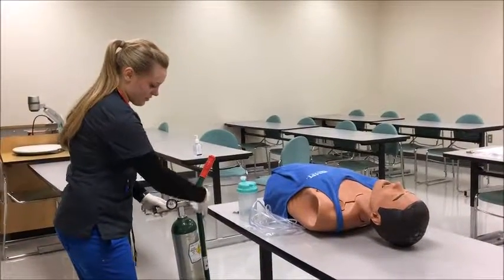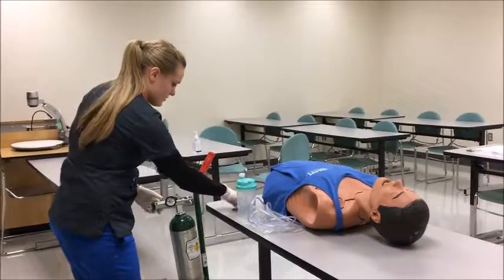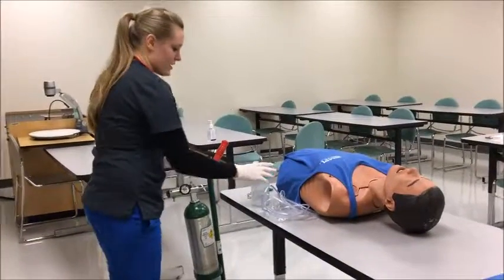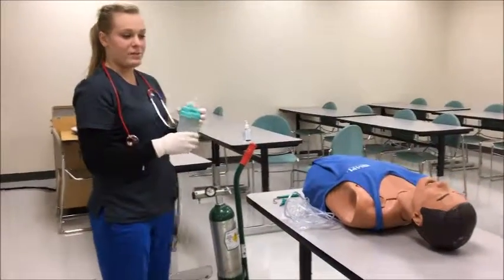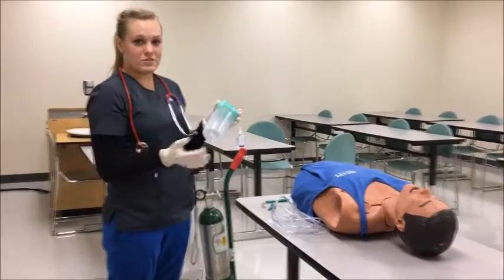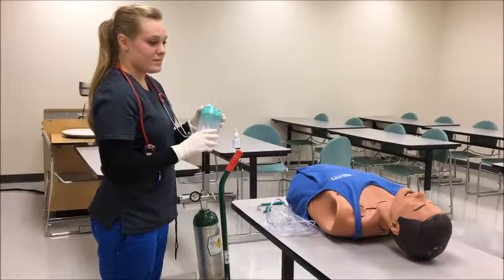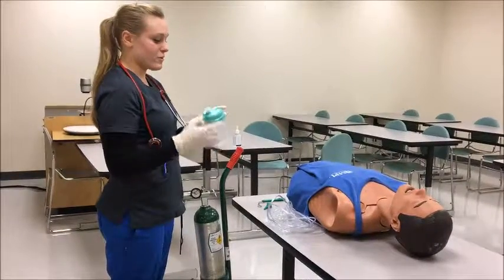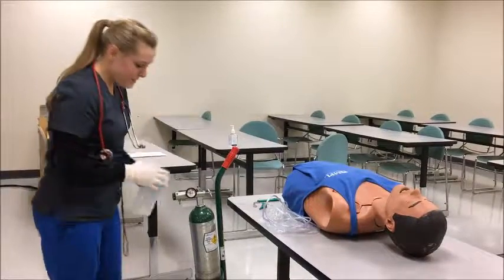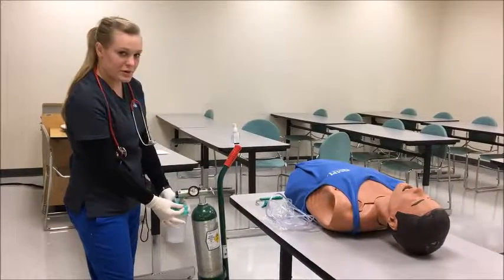This is our oxygen tank, and we're applying our flow meter, which measures the flow. We would use this to crack open the oxygen tank and make sure the oxygen's flowing. And I'm going to go ahead and put him on a humidifier because I'm at 6 liters a minute, and higher than 4 liters a minute on a nasal cannula, you would have to add a humidifier. So I'm going to add it for you so it's comfortable and you're not sore in your airways. I would fill it up with sterile water, attach it to this oxygen tank, and then the nasal cannula port will go right here.